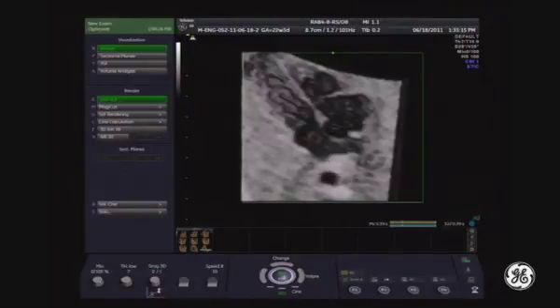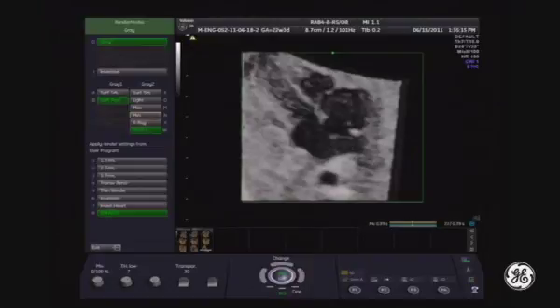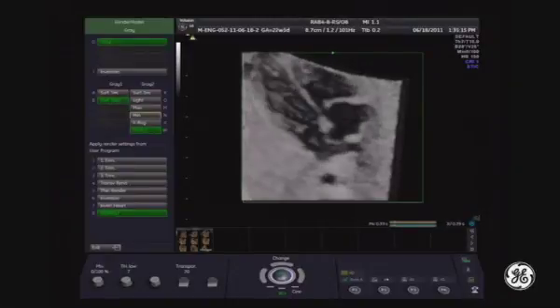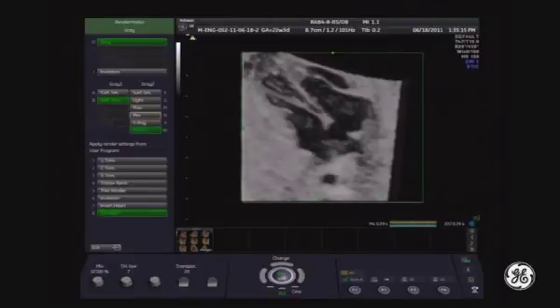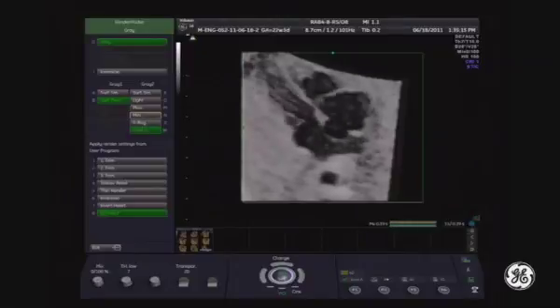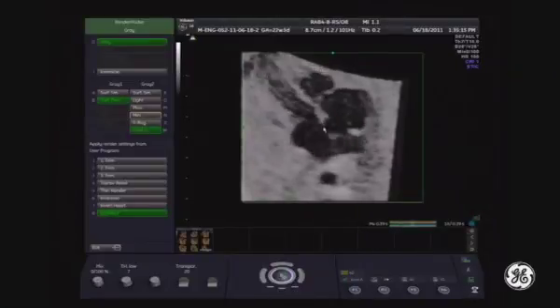And in rendering settings, you should check the transparency. For most of our cases, we use low levels of transparency. So here you have 20. And be careful, because this is quite advanced imaging, and you need to wait until the machine processes it. So finally, you have it. You see the foramen ovale flap very nicely here.